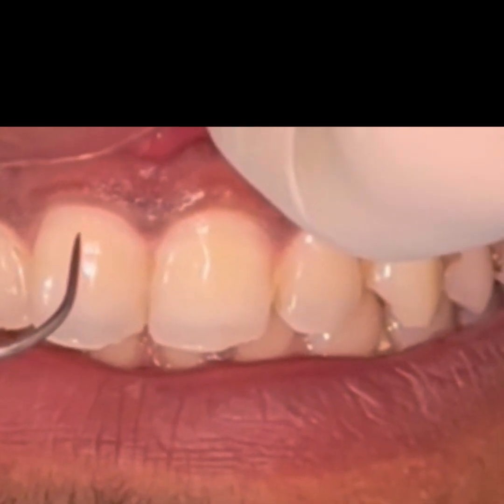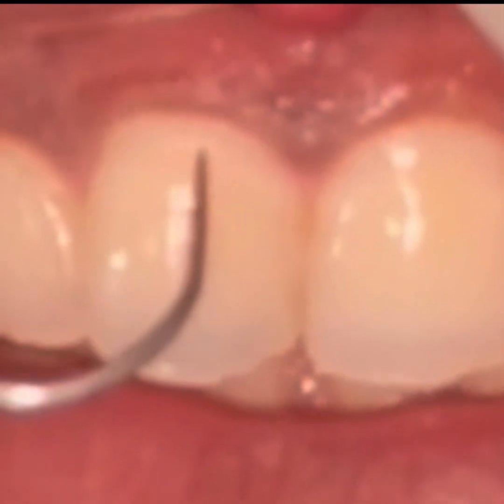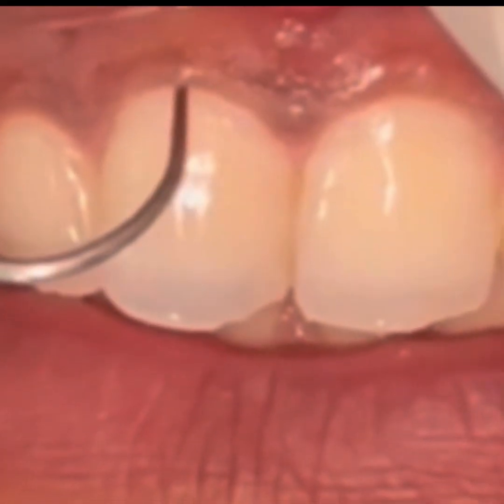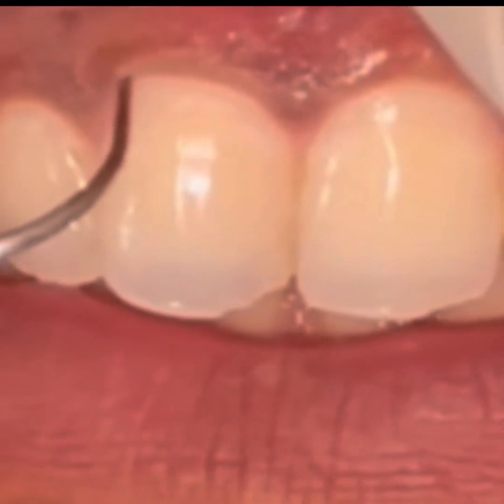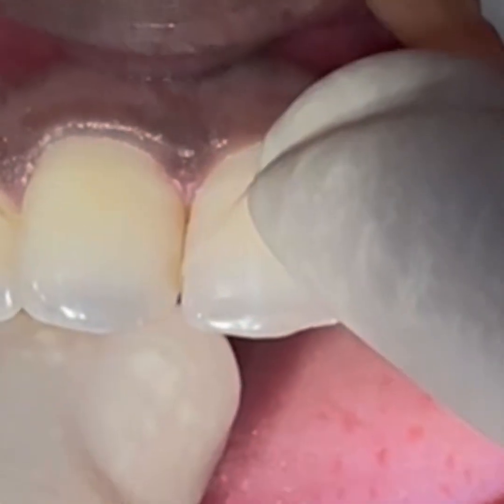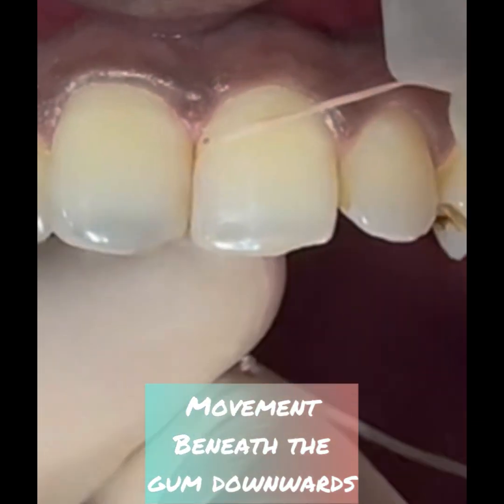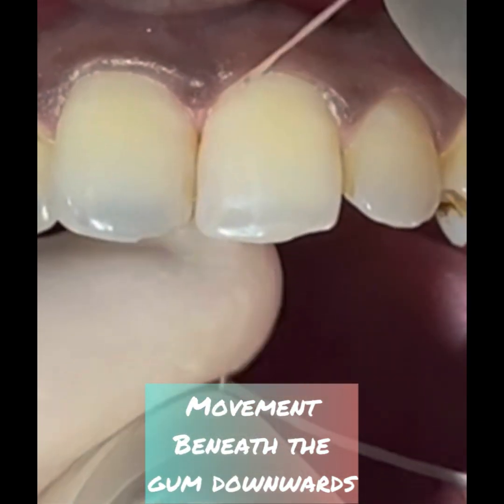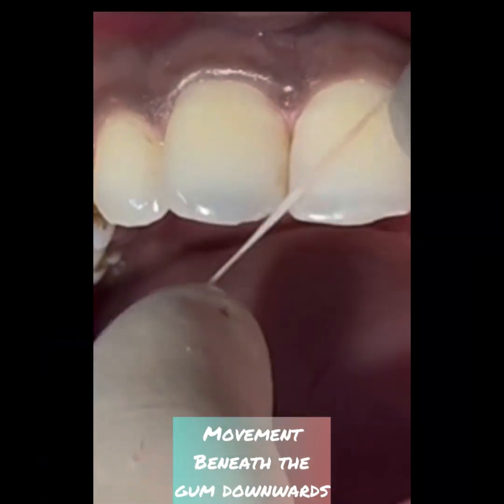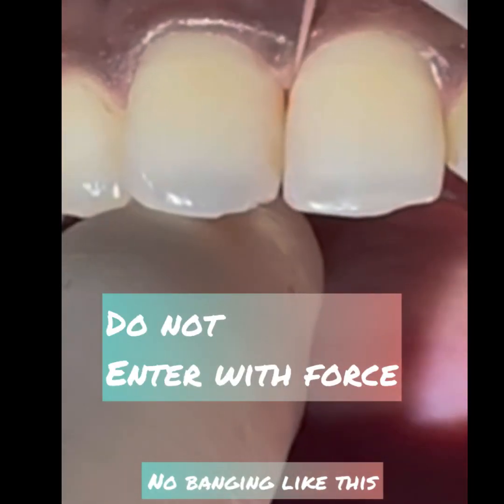You will recollect that there is a sulcus where the tooth and the gum meet. So it runs all around the tooth. The small stretch is then pushed into the space, and it is done like this. The important thing is that you should not go with a thud, otherwise it will hurt the gum here.